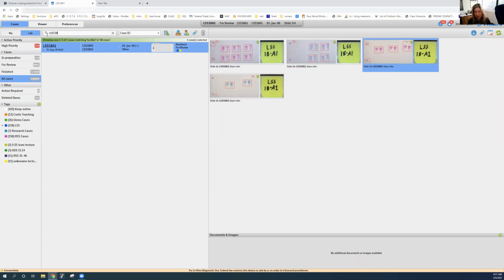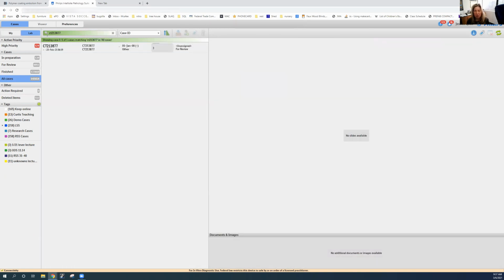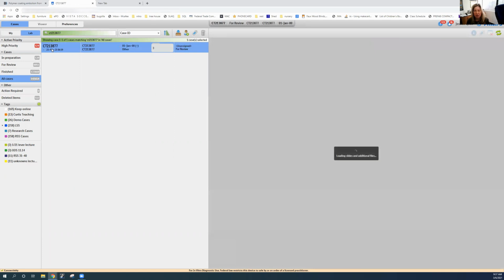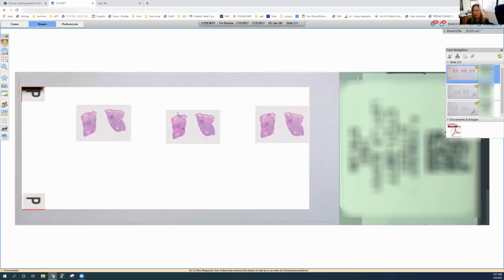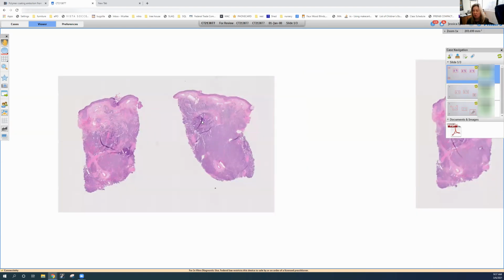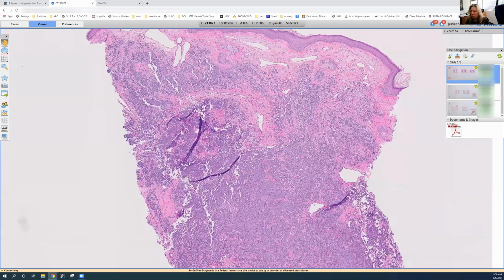But sometimes they can be difficult to find, and I've done step level sections through the tissue block with H&E and PAS stains to find the dermatophytes in Majocchi's before, and that works pretty well because they're often not in the initial level sections. And sometimes there are very few organisms.